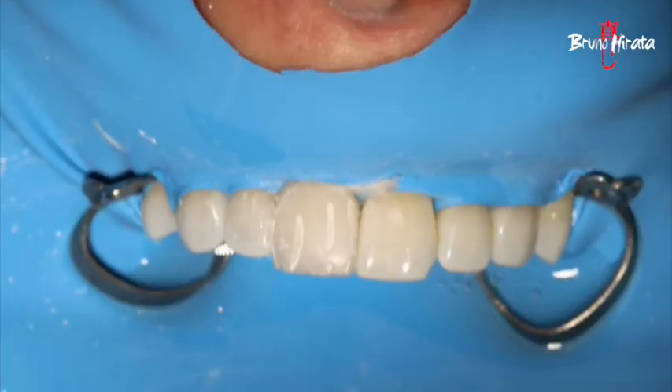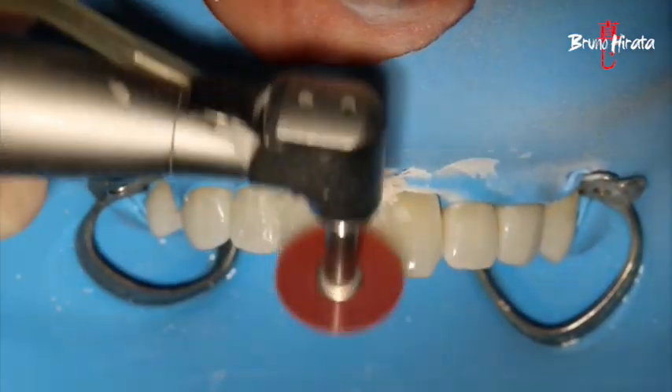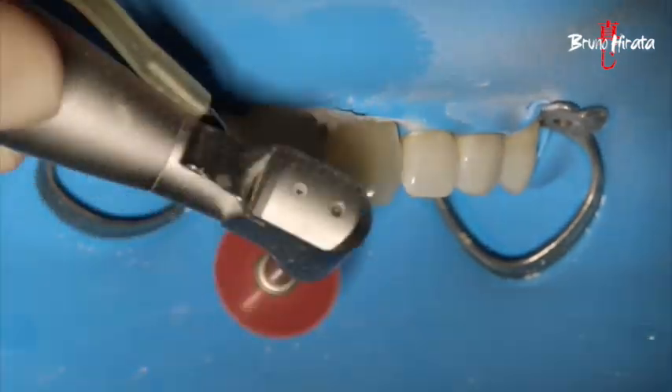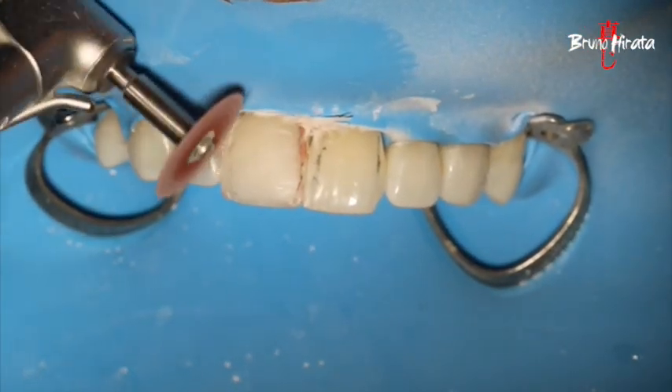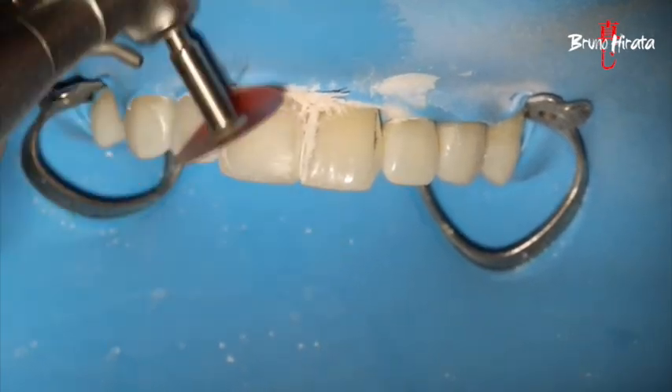After the resin, we removed the excess using an aluminum oxide disc, providing the right-plane inclination in all three thirds of the tooth, giving the restoration the ideal contour.